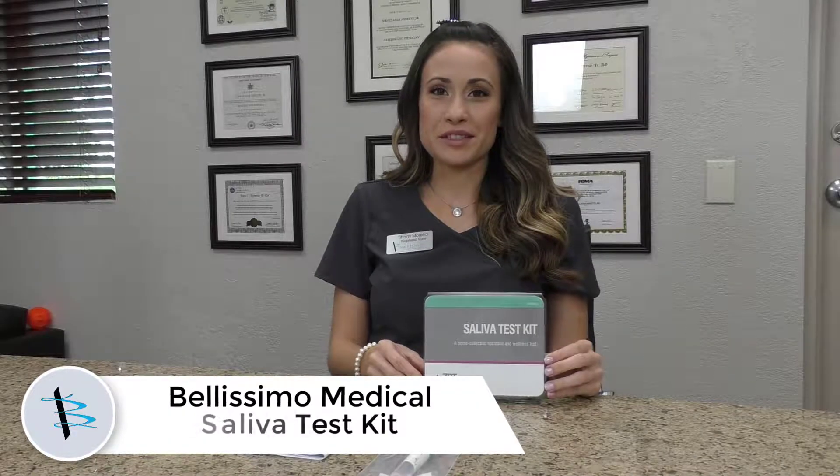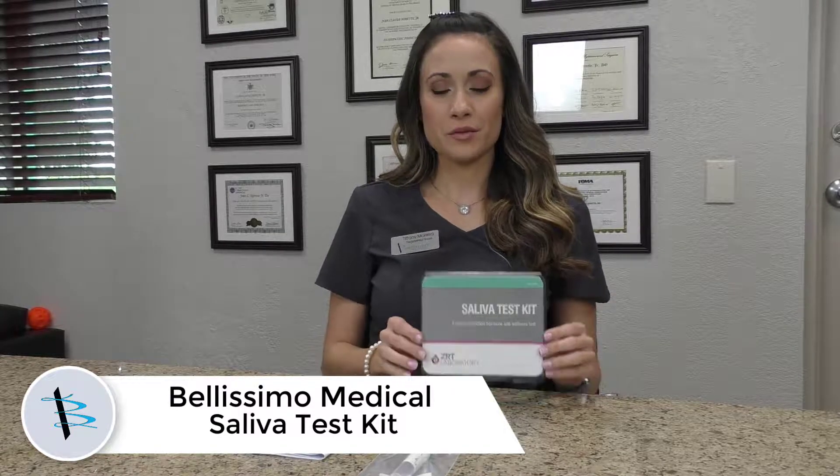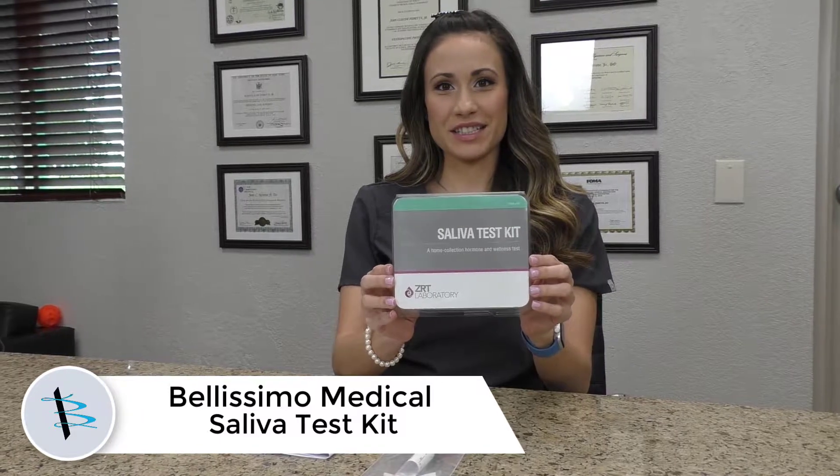Hi, my name is Tiffany. I'm a nurse here at Bellissimo Medical and I'm going to go through how to take a saliva sample with our ZRT saliva test kit.